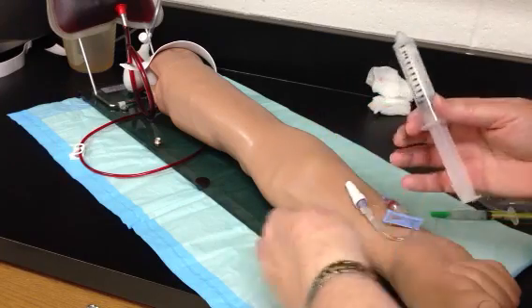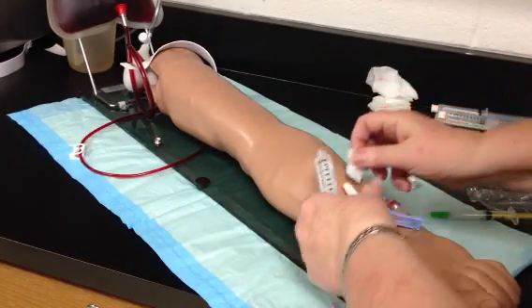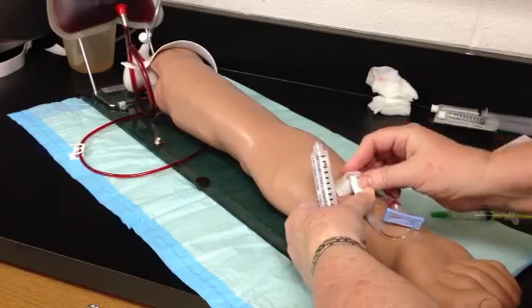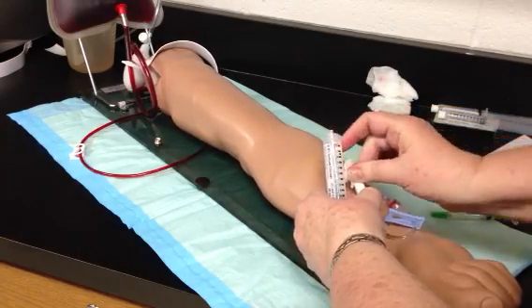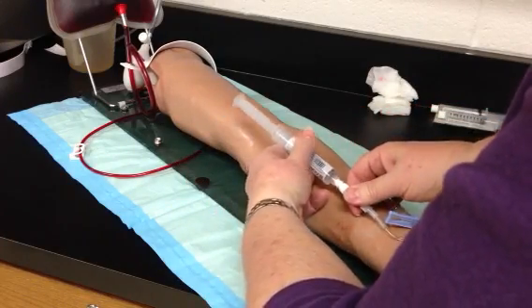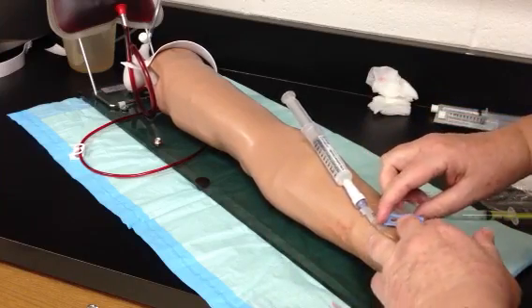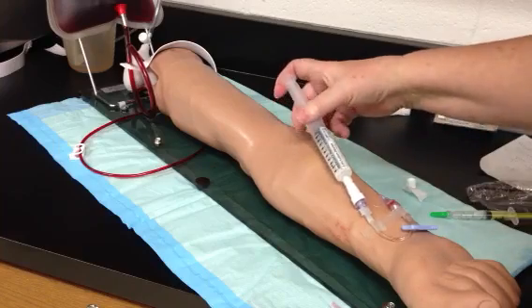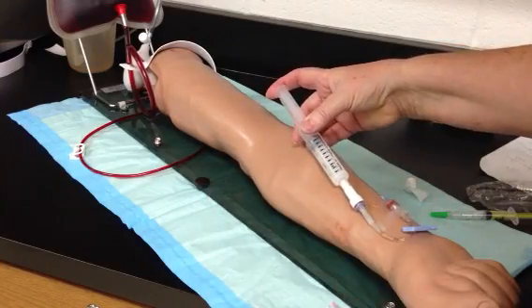Alright, I'm going to scrub my injection port. I never want to access a port unless I have thoroughly scrubbed. Do a vigorous little scrub. Screw this on. Unlock my saline lock, because it should always be left in the locked position when it's not in use to prevent blood flow from backing up into there.